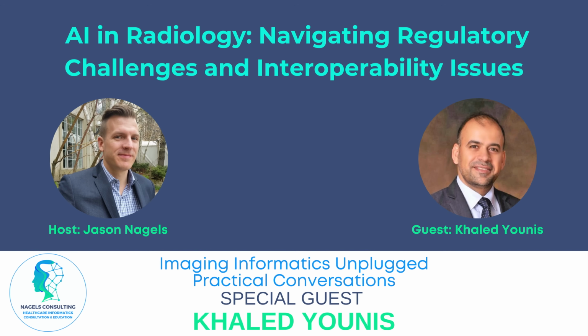The model wasn't actually discriminating between people who have COVID and those who don't. It was actually classifying whether this is a pediatric patient or an adult patient. That ends up in complete ignorance of the population and bad performance on pediatrics. So this requires adaptive AI systems and diverse AI development teams.